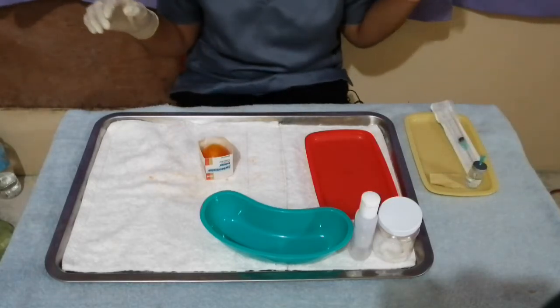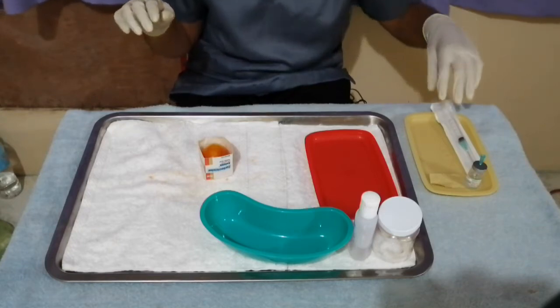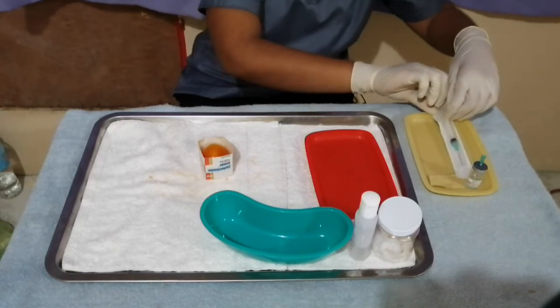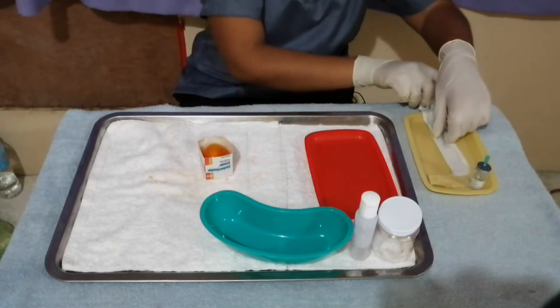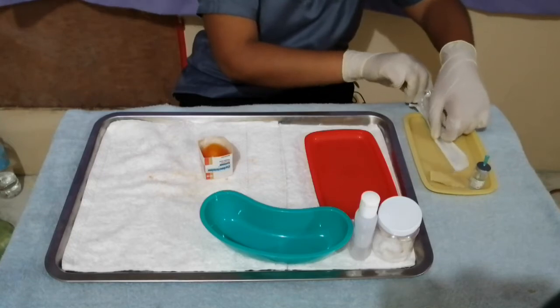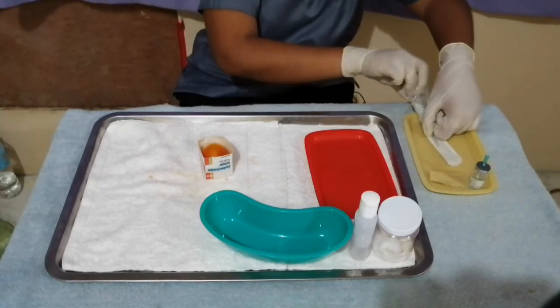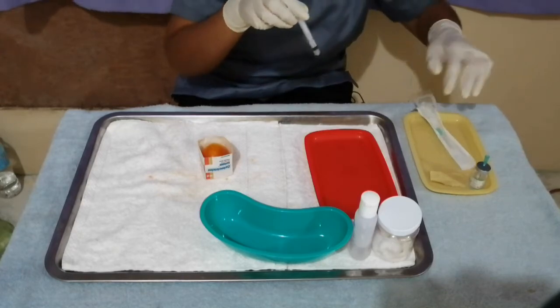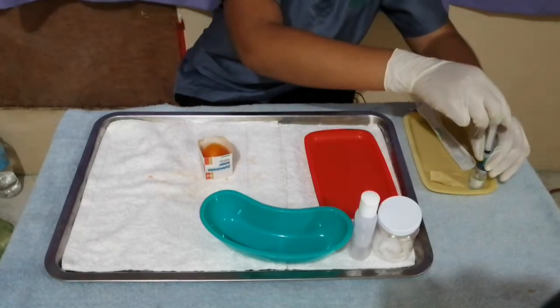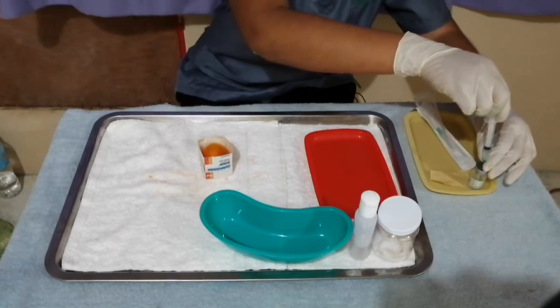Next, we're going to withdraw the drug with the prescribed amount of dosage, and I'm assuming that we're already done aspirating. Next, we need to get the right amount of dosage that we need.